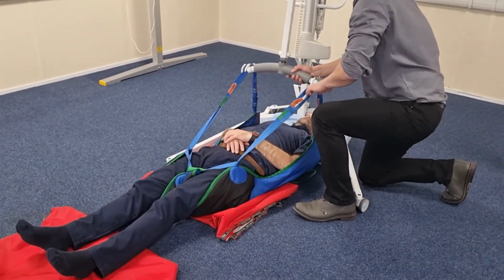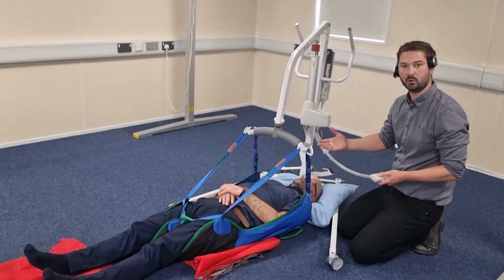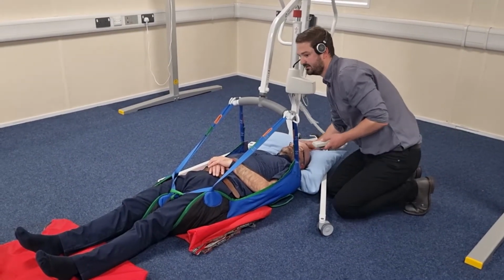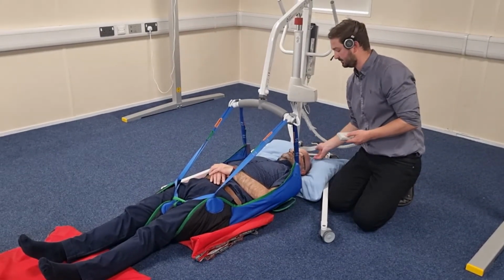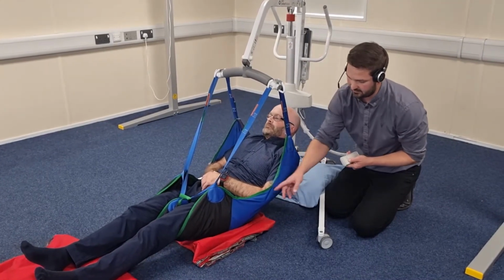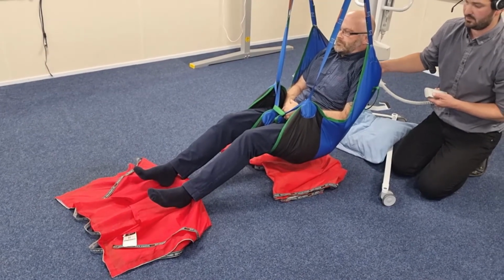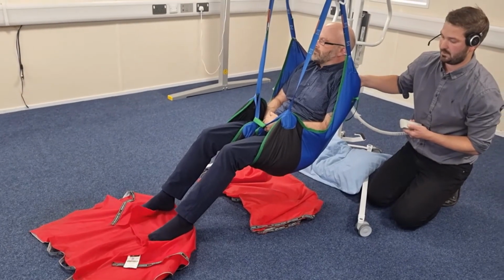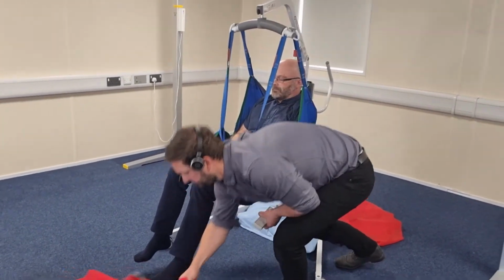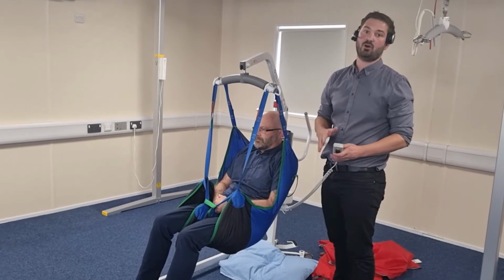So once we're attached, I'm just going to do another visual check, make sure that as we start to lift up, the sling's hooked on safely, slide sheets are in a good position, and the pillow is providing support against the framework. So I'm going to start to bring a person up. As you'll start to see the slide sheets coming into effect now, just creating that barrier. There we go. And then once the person is at a good height, I can then transfer them into either seating or back onto bed.